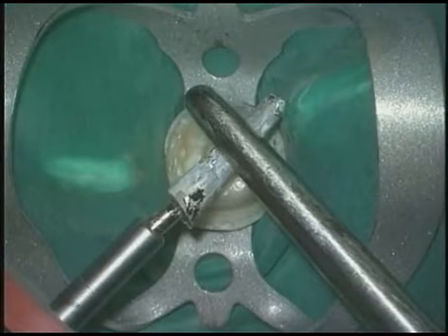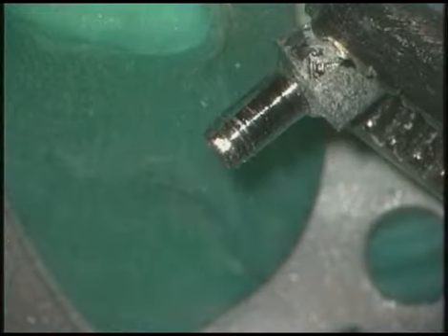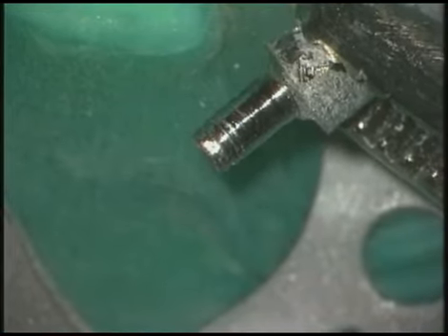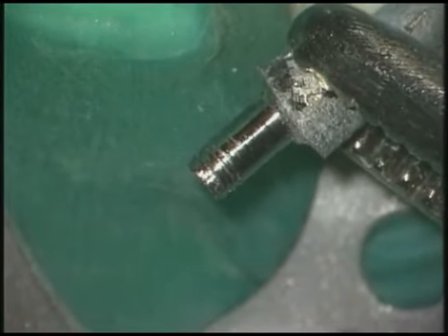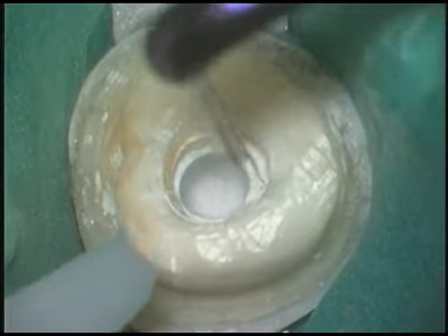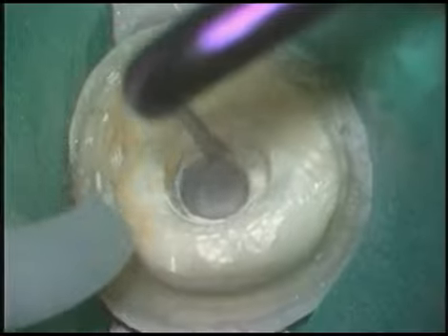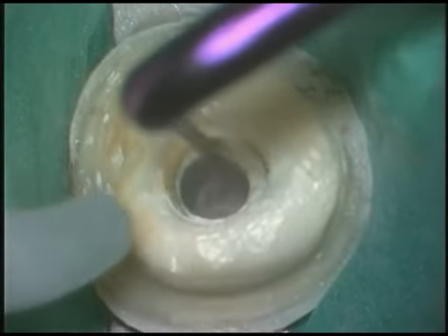It's useful sometimes to see the power of the system. With the liberated post, you can see that just 2 or 3 threads are sometimes all that stands between success and failure. I like to select an ultrasonic titanium instrument because of its smooth, efficient cutting action.